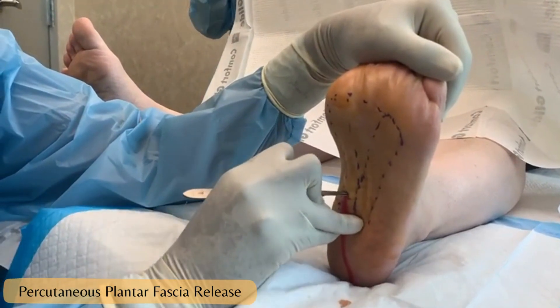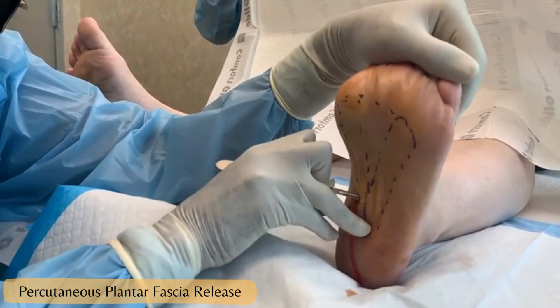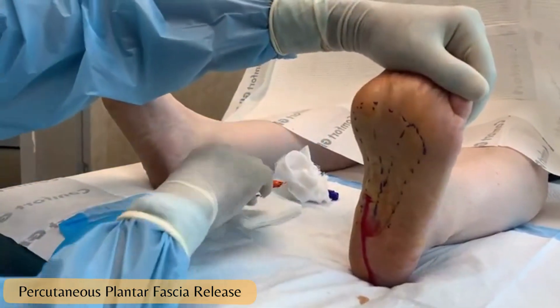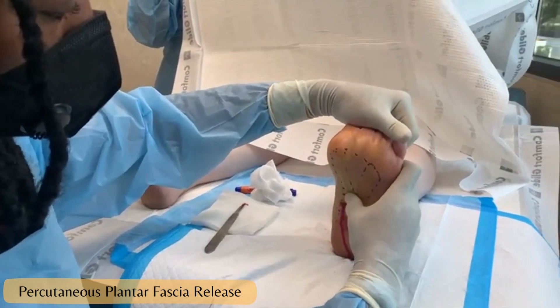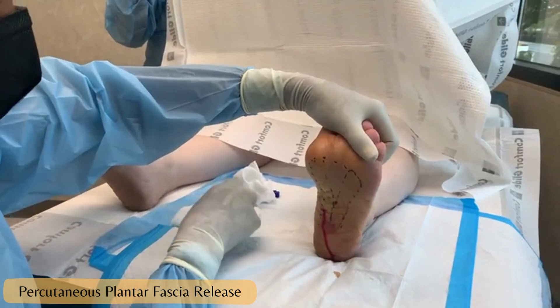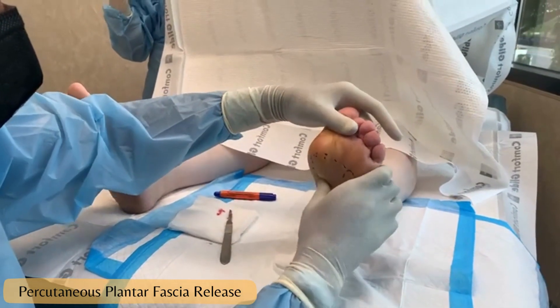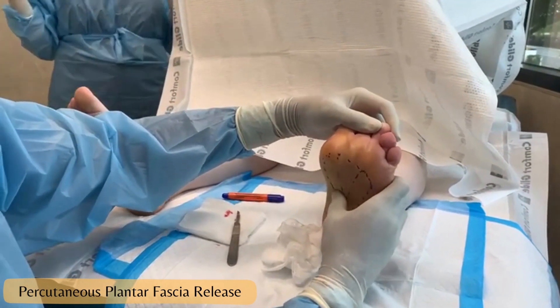We checked in with the patient — doing okay up there? Yeah, doing okay. The angle right here is now a lot looser, indicating a successful release.